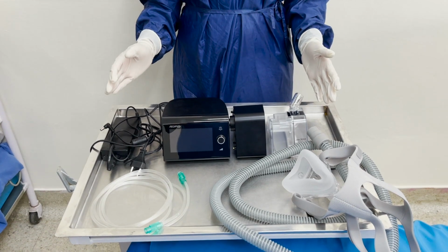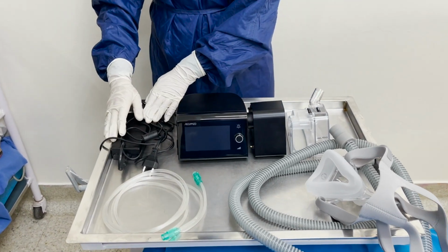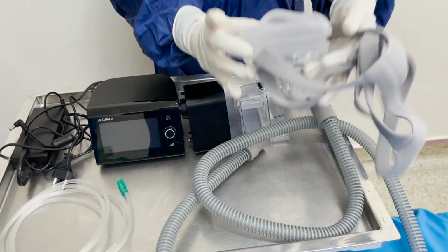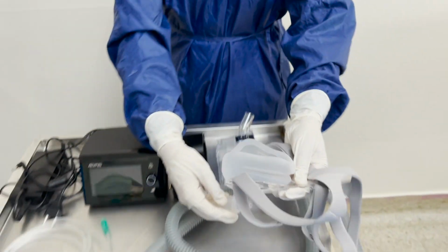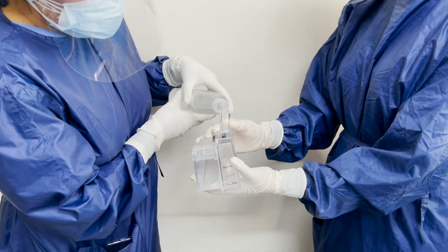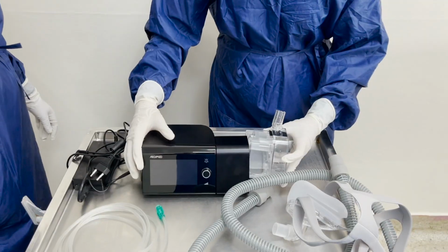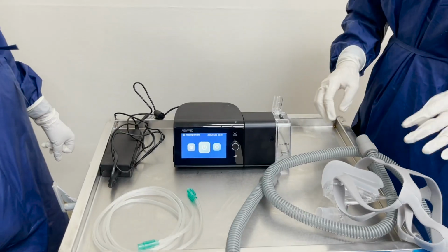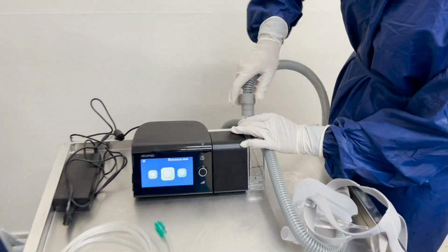We are demonstrating the device available at our emergency room. This is the device with its parts: power source, humidifier chamber, connecting tube, the oronasal mask with expiratory valve, and the port for oxygen connection. Most of them require an electrical power source. The humidifier of the machine should be filled with distilled water up to the level mark given. The device should be set beforehand, and then only the mask should be applied. For further detailed explanation regarding how to set the various pressures of BiPAP and CPAP, please follow the link given.